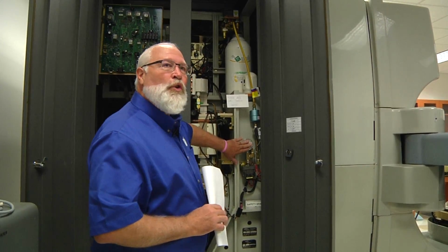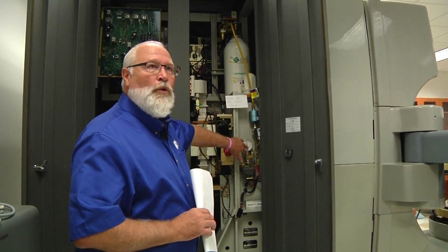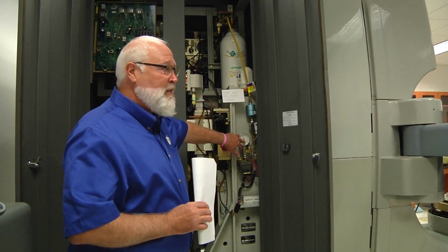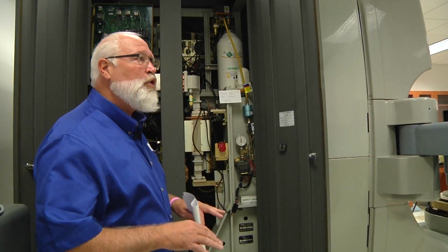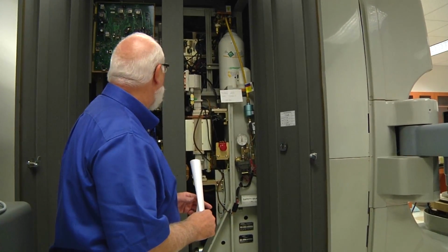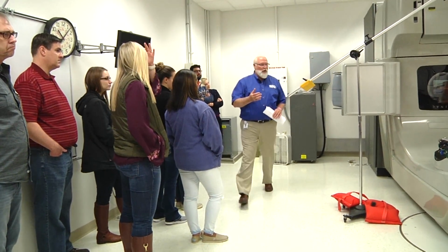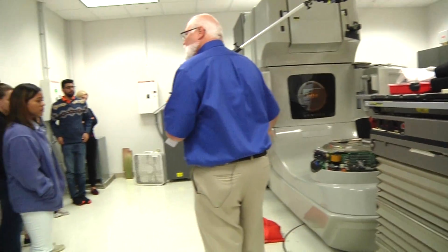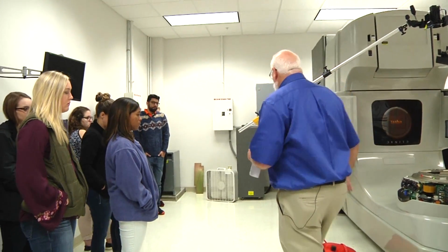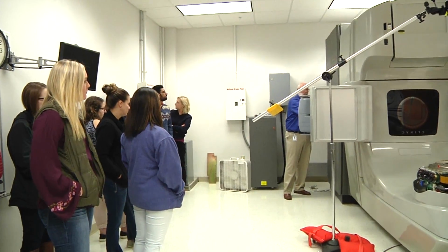So that's why you write these numbers down when you do your morning check on a variance system. Siemens and Elekta, theirs are a little different on what you'll do to warm up the machine. Some of the other things you'll look for, you always want to look for fluids or stains, water stains. I mentioned before, you might have that oil leak.